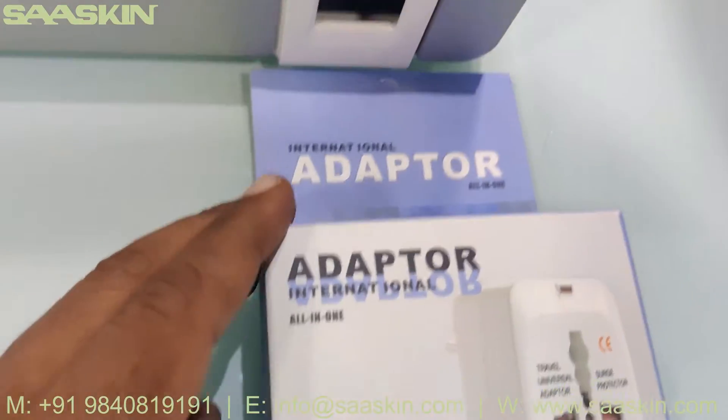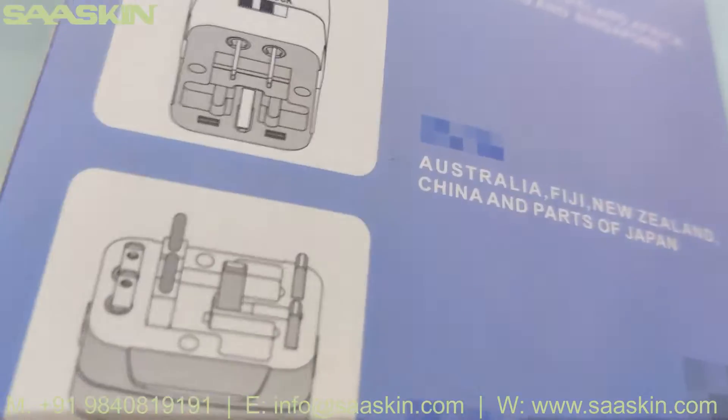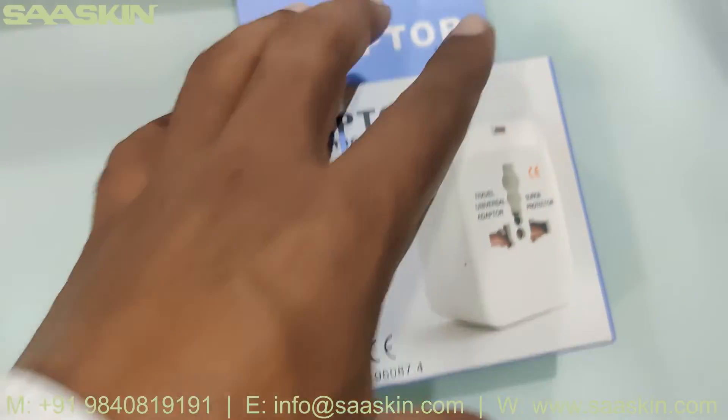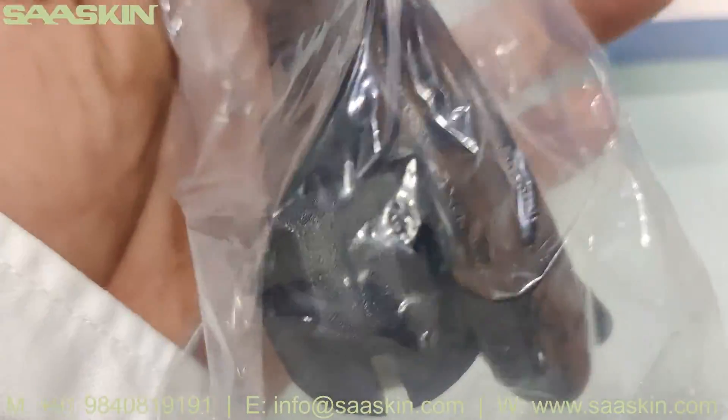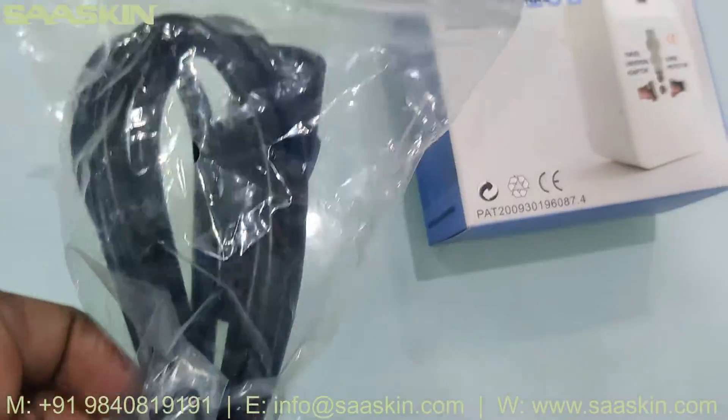Along with this main box you get one adapter. You can see there's one international adapter. And there's one power cord that goes with the adapter.